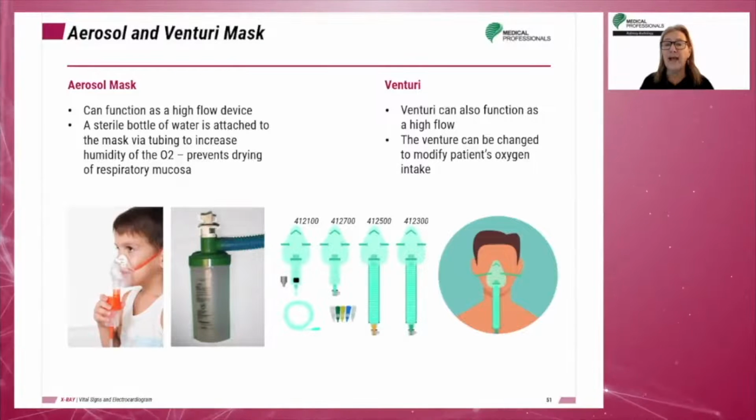The Venturi mask can also function as a high-flow delivery system. The Venturi valve can be changed to modify the patient's oxygen intake as needed.